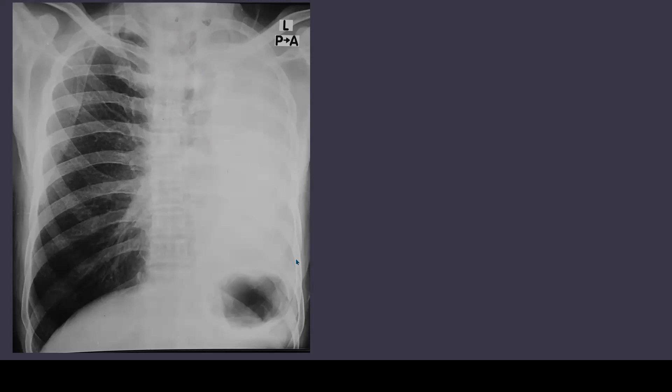This is an x-ray of left lung collapse, and as a compensatory mechanism you can see that the right lung appears more black compared to normal. This is due to compensatory hyperinflation of the right lung.